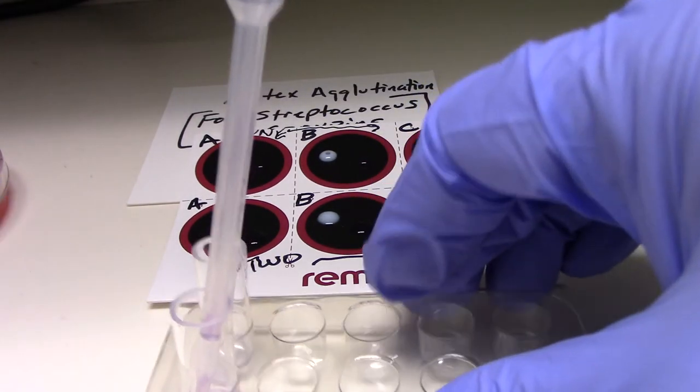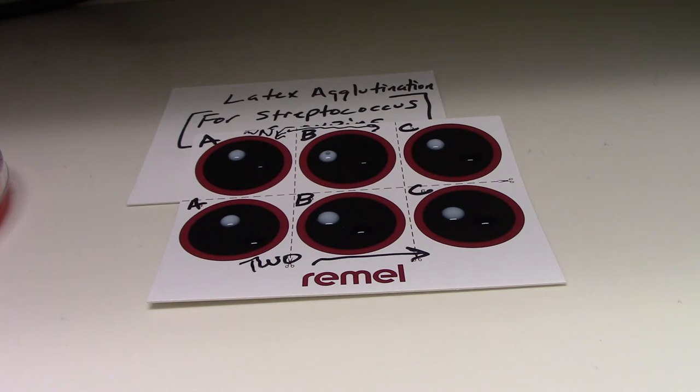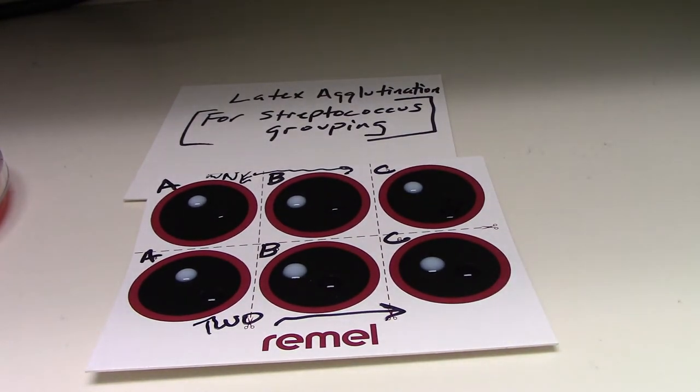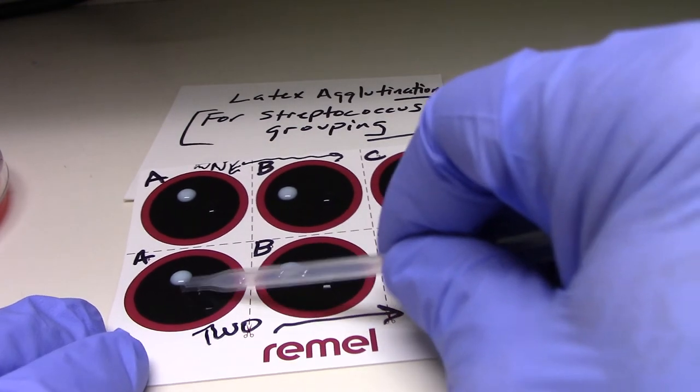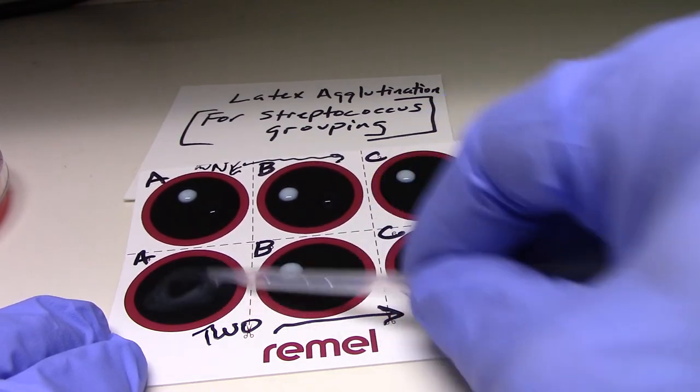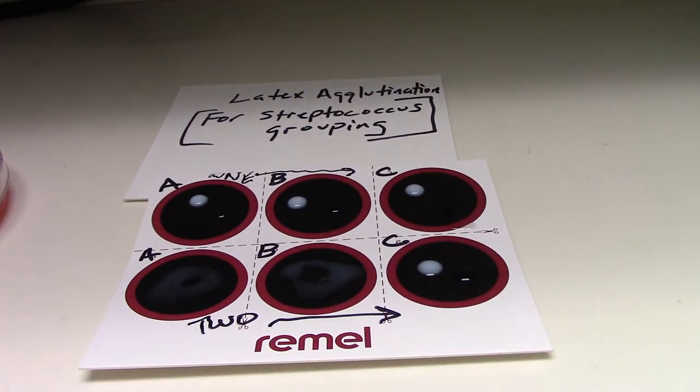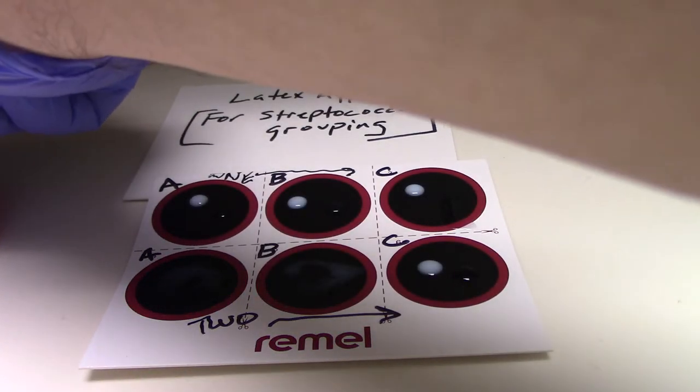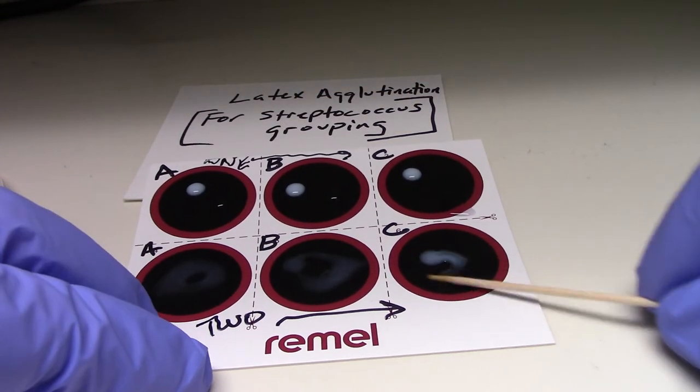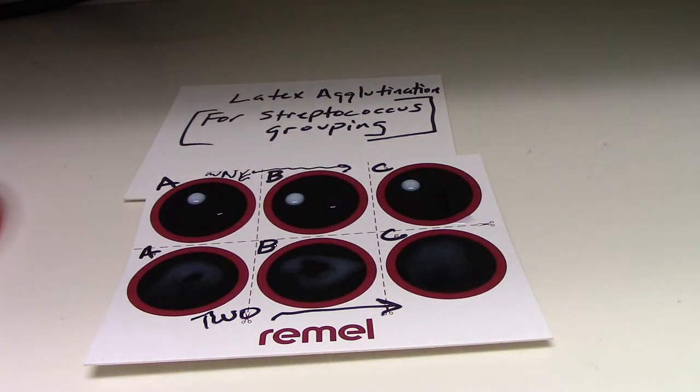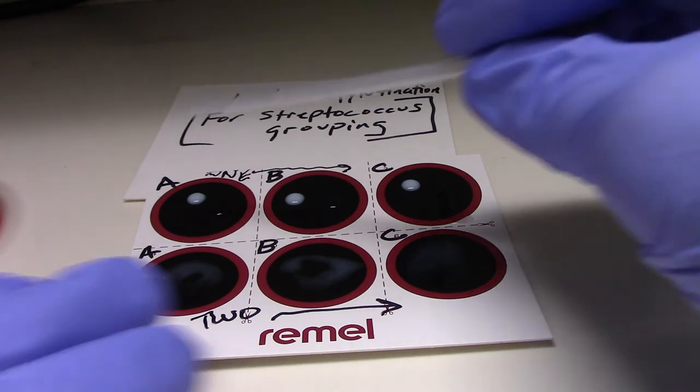So we have two specimens, specimen number 1, specimen number 2. We're going to mix these together and look and see if we can detect agglutination. So we're going to come here and do number 2, and then we're going to come across and do number 1 and mix number 1.